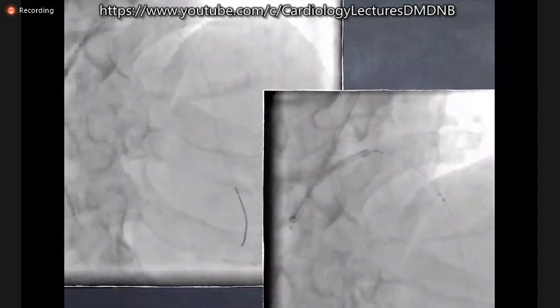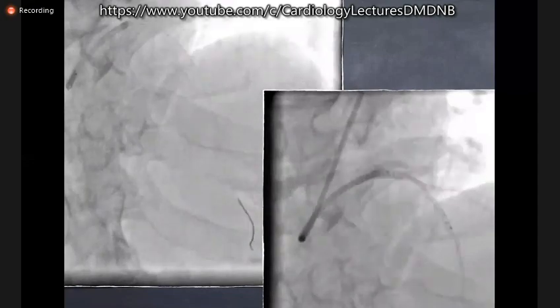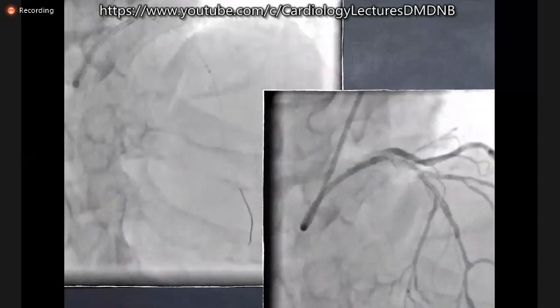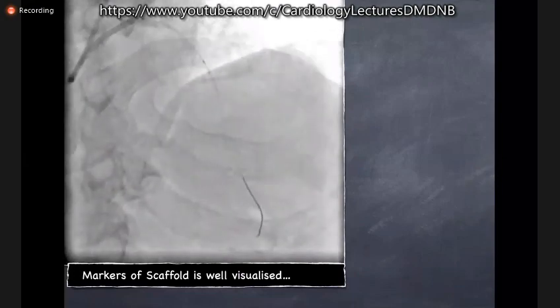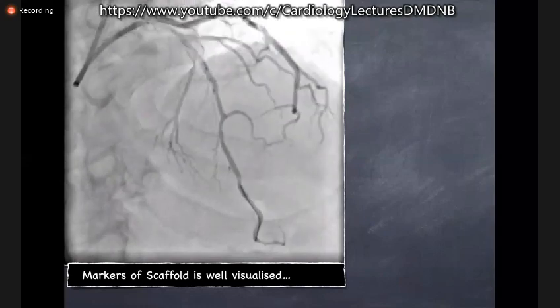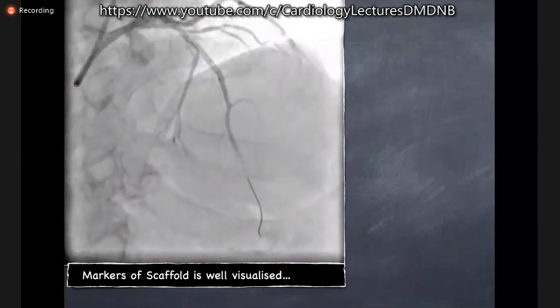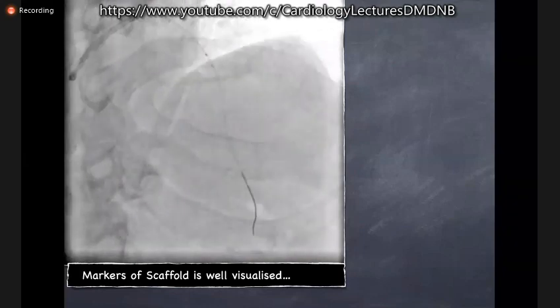In the second image, you could see the scaffold position. We wanted to pull back the scaffold a little more proximal to bring it back near the ostial LAD. We were very careful in doing that. Millimeter by millimeter, we tried to pull it back, but at some point the guide catheter just lurched inside. Following that, the scaffold got dislodged a little distally, and the balloon came back a little proximally. So you could see that the balloon is proximal to the scaffold.